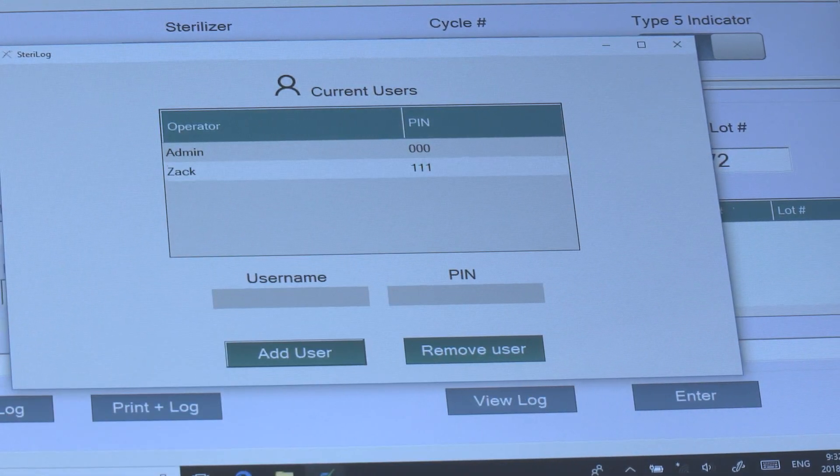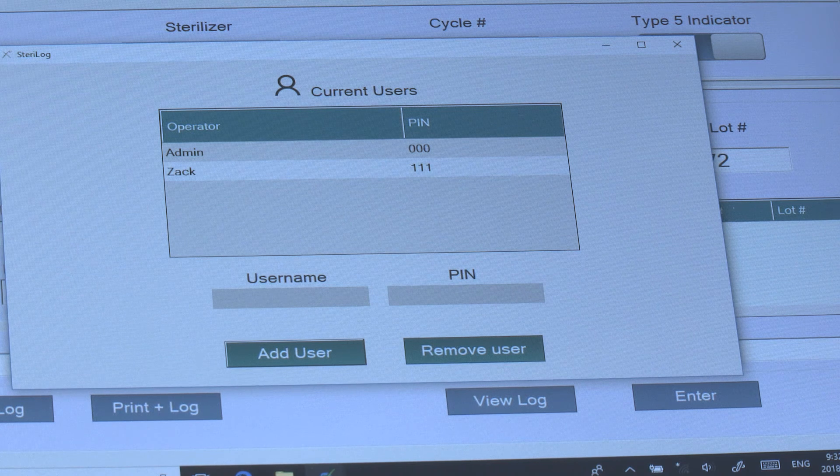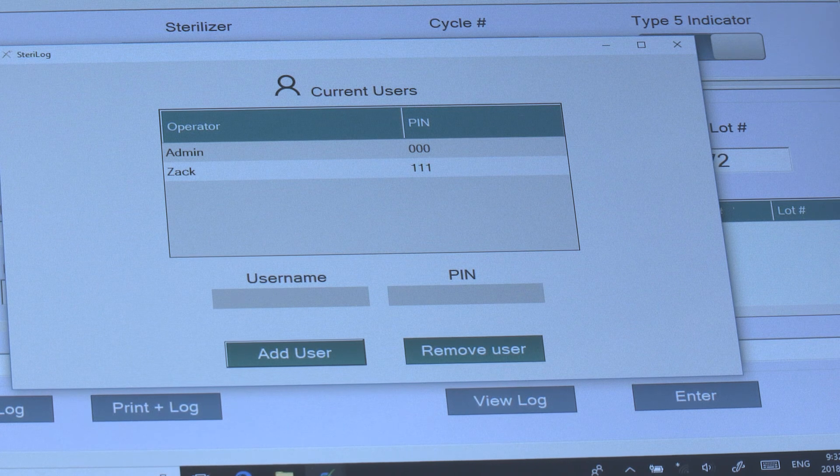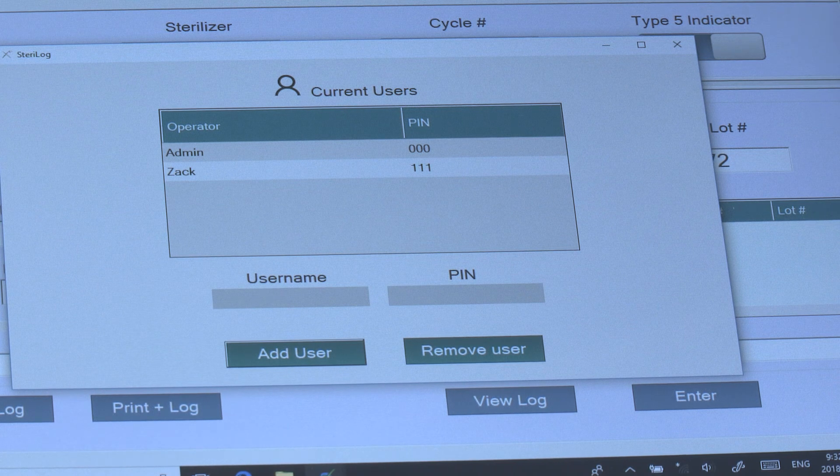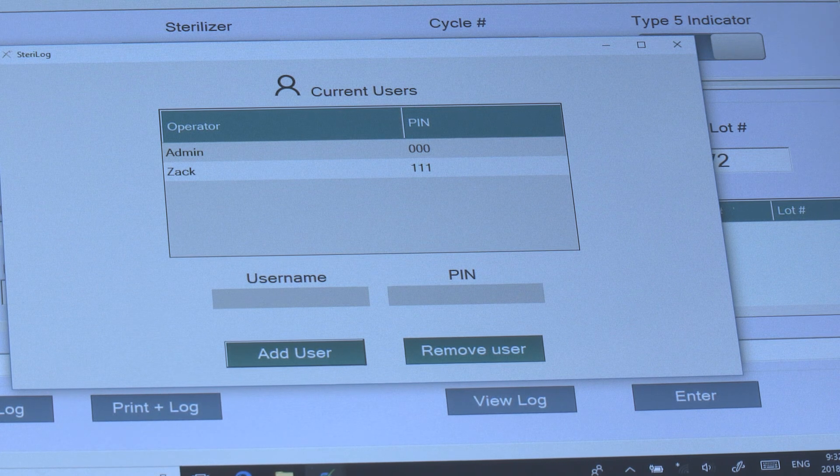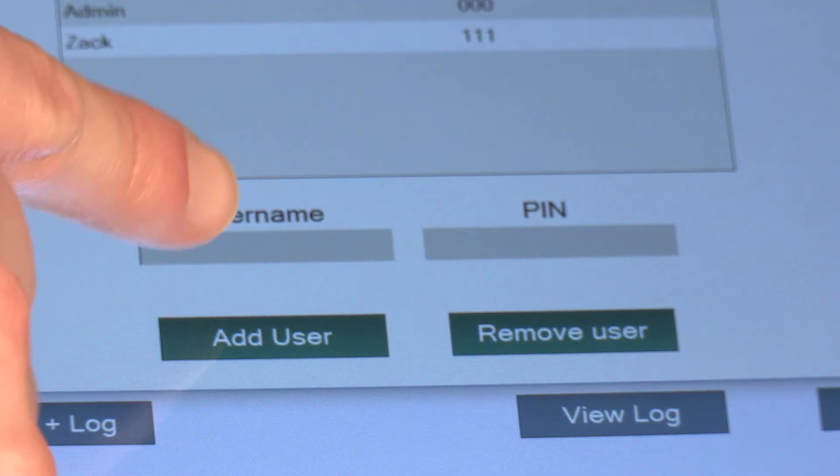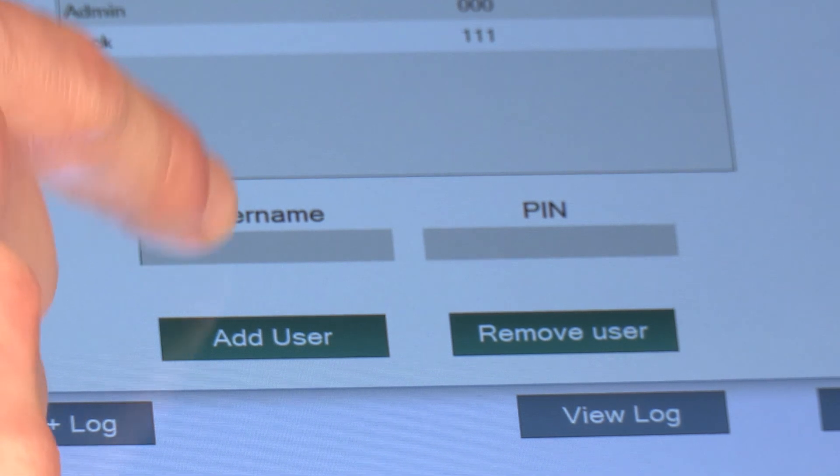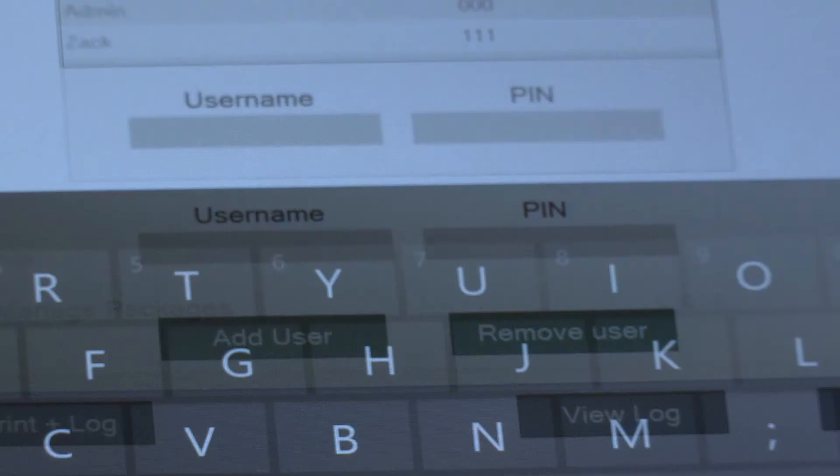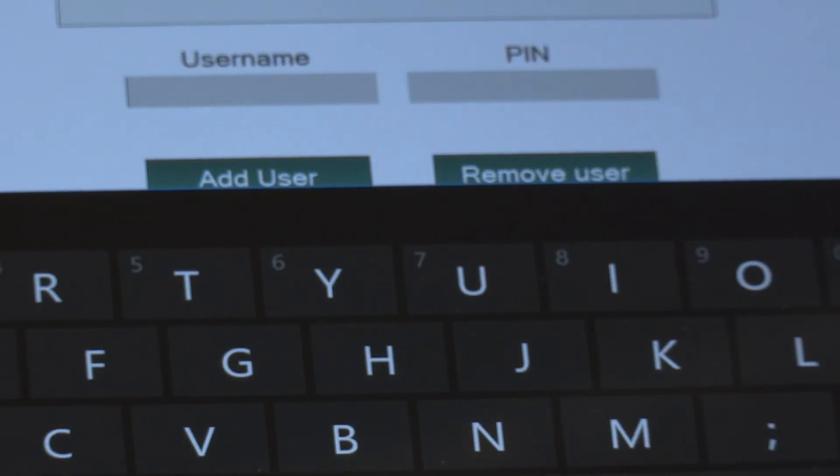You'll notice that Zach has now been added with PIN 1-1-1 and we can set up multiple users. To add a user we'll just click on the username field here and key in the name.